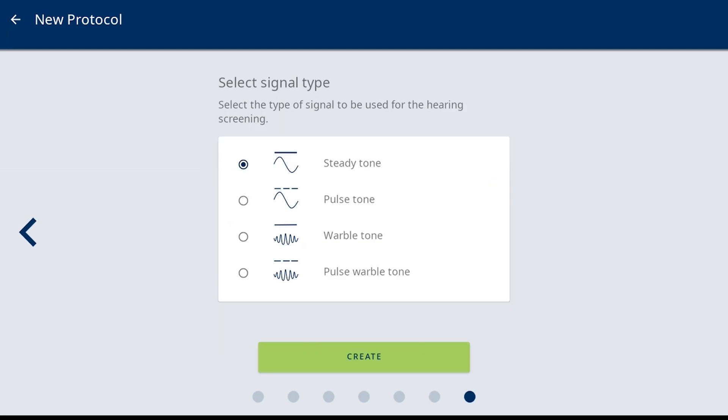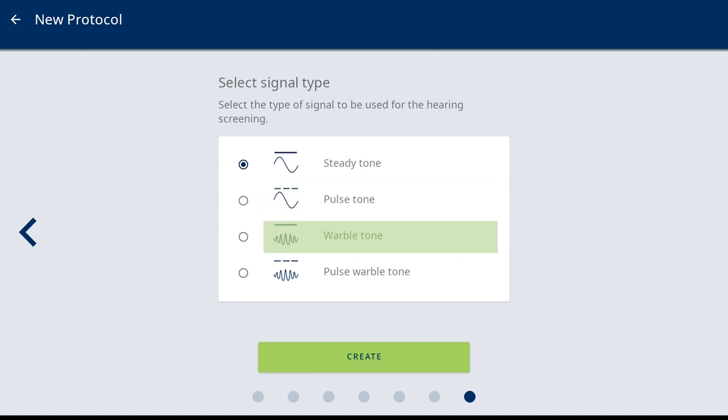The last setting is Signal Type. The selection options are Steady Tone, Pulse Tone, Warble Tone, and Pulse Warble Tone.